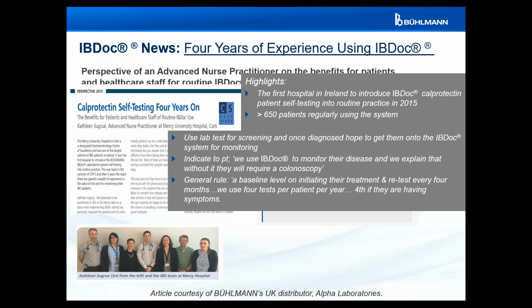They indicate to the patients, we use IBDoc to monitor the disease, and we explain that without that, they will require colonoscopy. So obviously a little bit of motivation there for the patient. As a general rule, they take a baseline level when initiating treatment and retest every 4 months, or sooner if they're having any symptoms.